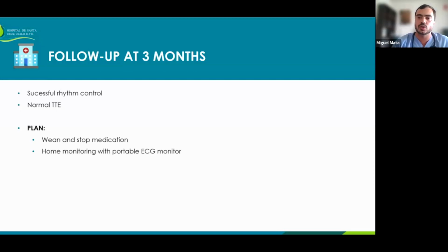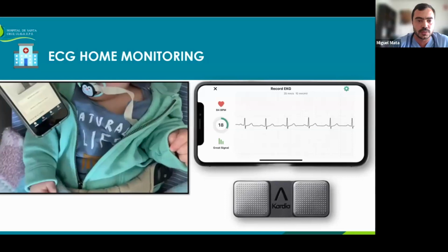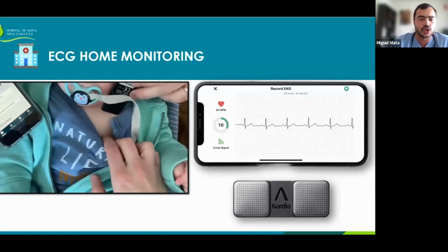And we will also use these devices that I actually met for the first time when staying with Dr. George and their team in Barcelona, the AliveCor KardiaMobile. So this is a device that is actually licensed for adults. And so for children to use it, you have to input an adult date of birth, but it's quite useful. And here you can see the video of its usage.